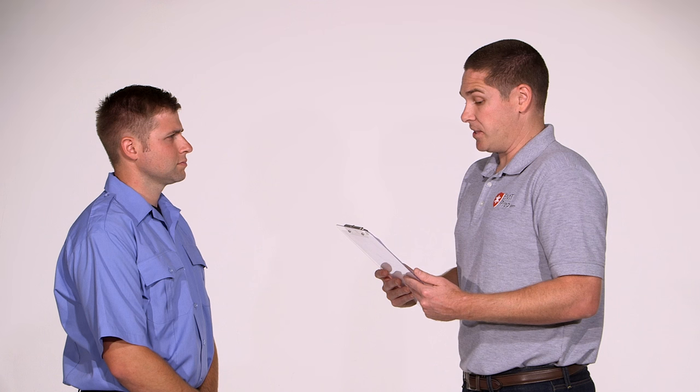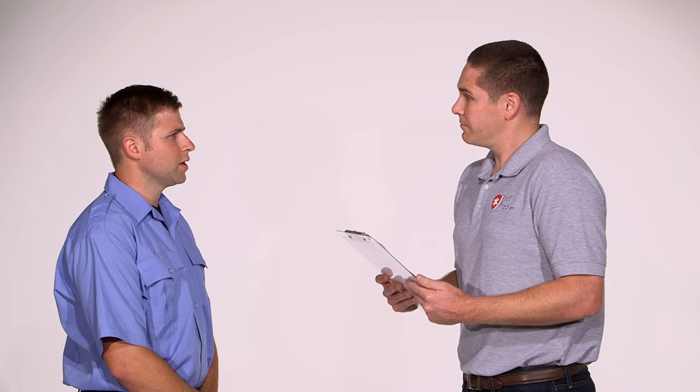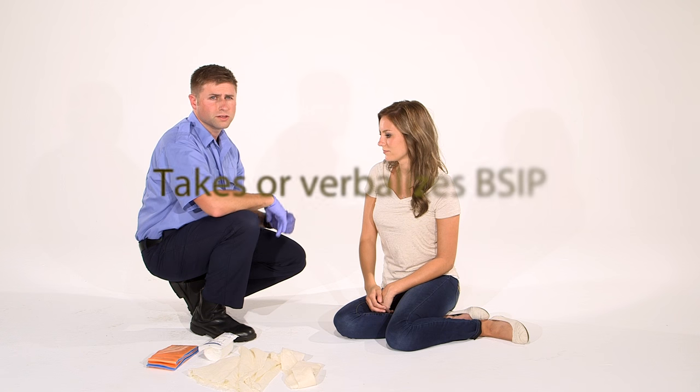Continued assessment of the patient's airway, breathing, and central circulation is not necessary in this skill. You may use any of the equipment available in this room and you have five minutes to complete this skill. Do you have any questions? I do not. BSI, my scene is safe.